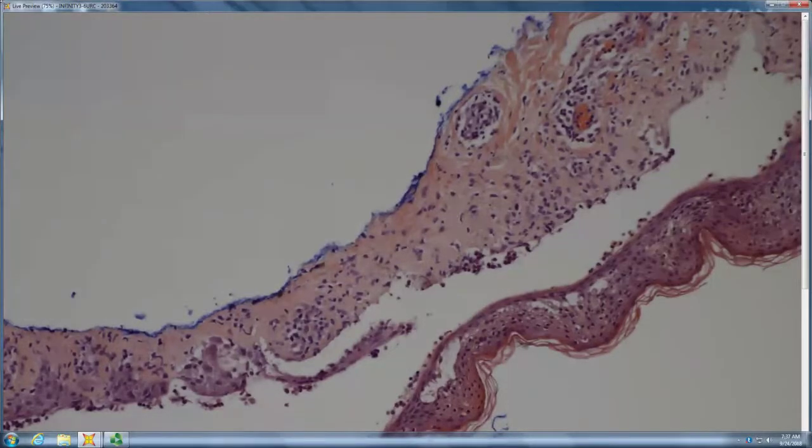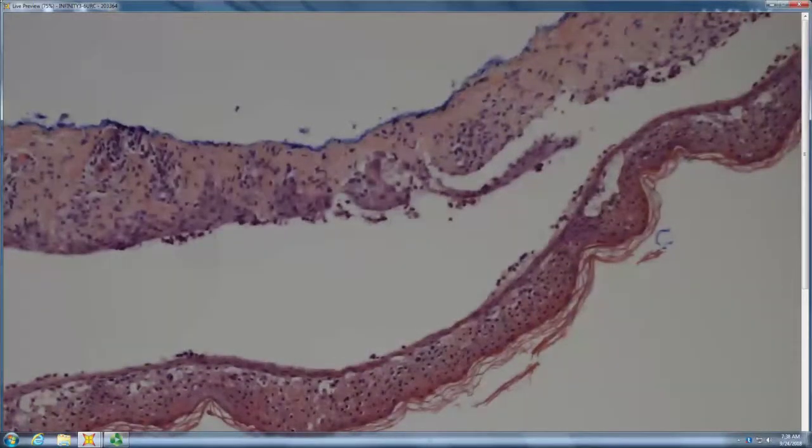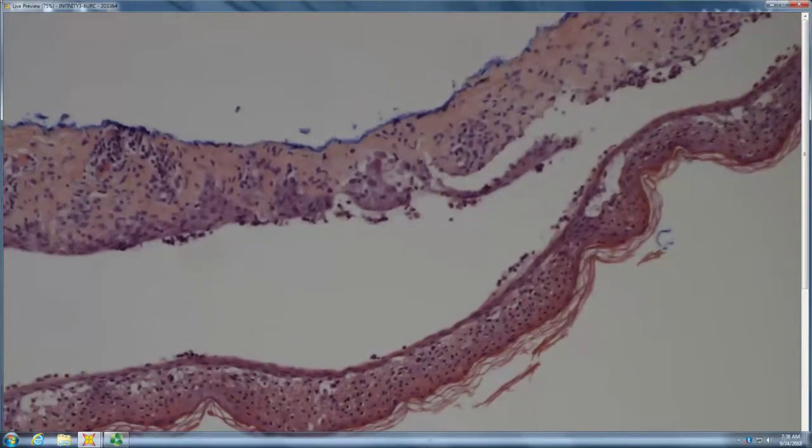And you need to look at the patient and you need to look at the immunofluorescence. In this case, immunofluorescence was positive for linear IgA. But it could be just as likely histologically that this was an EM-TEN-like picture with now some reepithelialization, and the neutrophils are just secondary. So that's why it's a nice example of how, without the clinical and the immunofluorescence, you can't navigate your way through some of these.